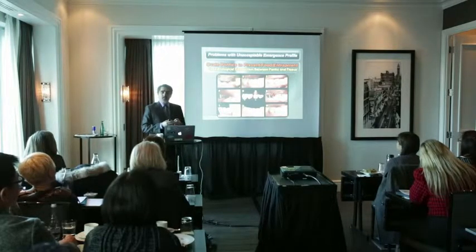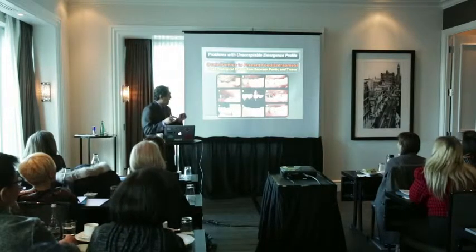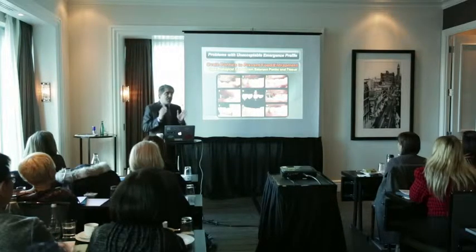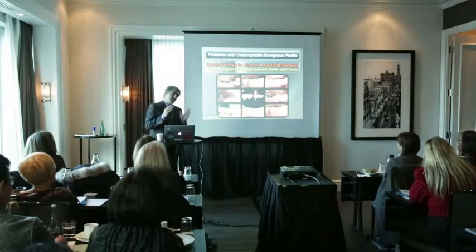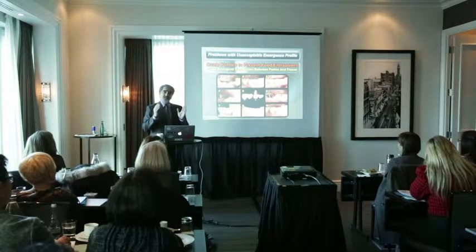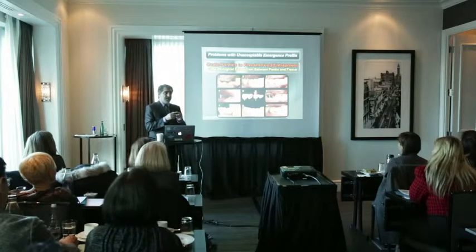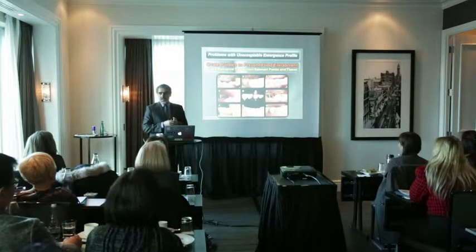Number one thing that you always have to do is recontouring. We don't have the picture of that, but recontouring the adjacent teeth is extremely important, just to make sure that your technician can provide a nice contact without having a black triangle. Although it's not visually a problem in posterior cases, definitely the patient is going to have a lot of problems with debris and food getting stuck in there.